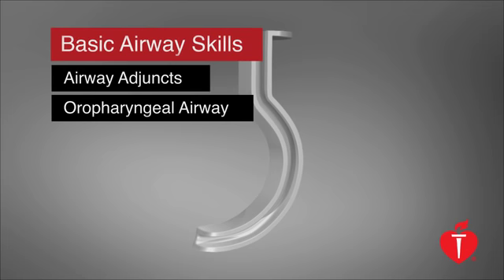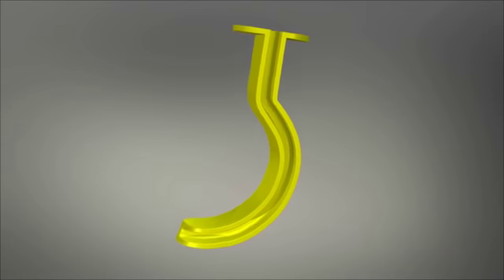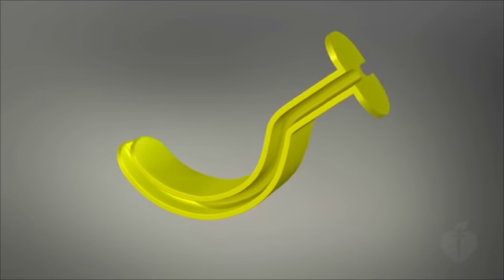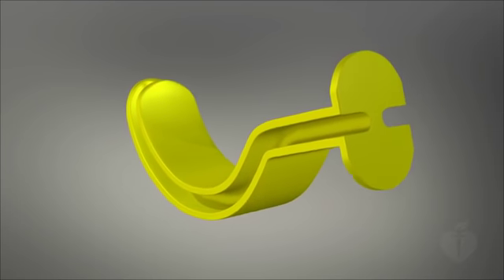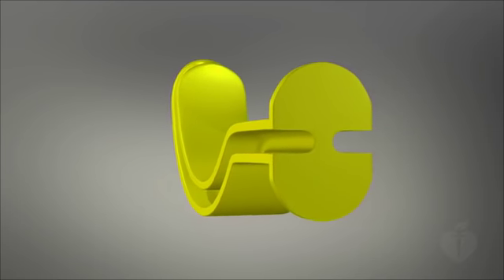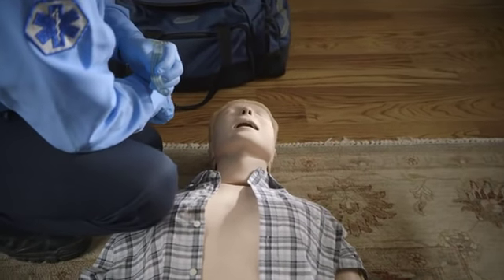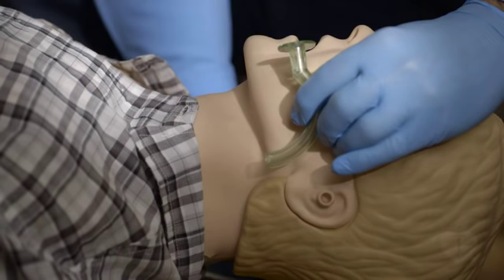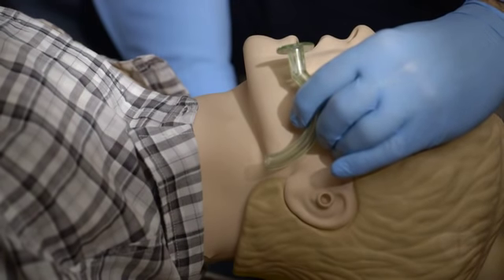The OPA is a J-shaped, single-use, disposable plastic device. OPAs are available in various sizes, with the most common adult size ranging from 8 to 10. Here's how to choose the correct size OPA. Place the OPA against the patient's cheek. When the flange of the OPA is at the corner of the mouth, the tip is at the angle of the mandible. A properly sized and inserted OPA results in proper alignment with the glottic opening.